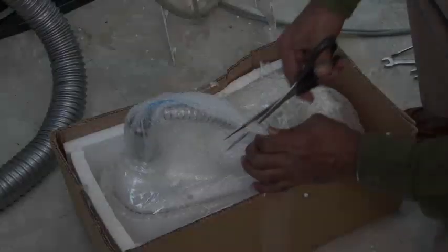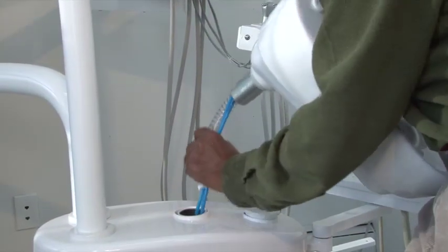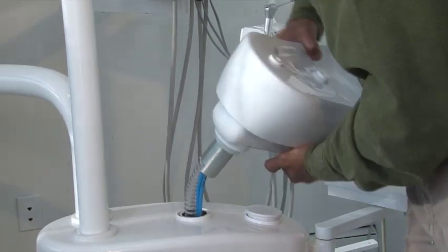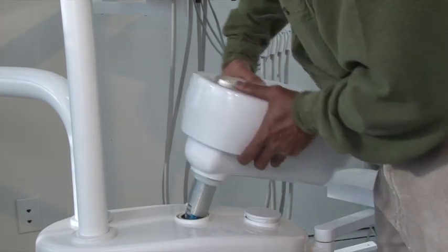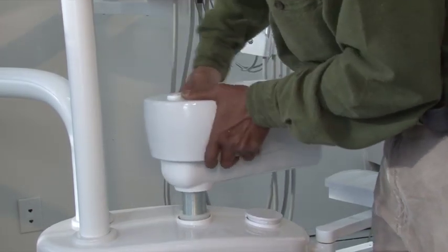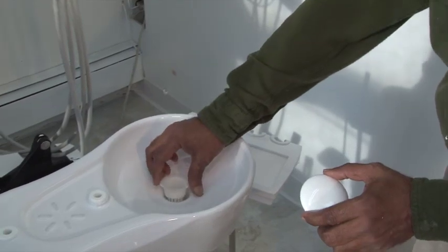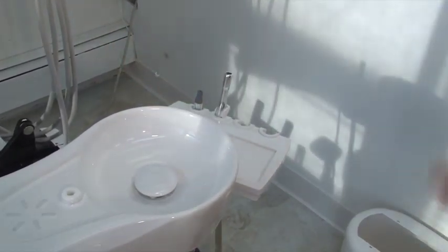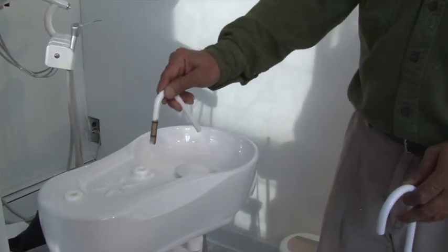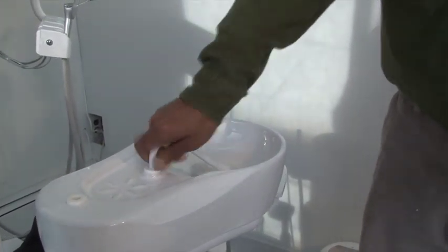Remove the protective plastic covers from the cuspidor. Insert the tubing through the cuspidor holder — the tubing are all marked — and place it on the cuspidor holder. Locate the cuspidor filter and the cap from the accessory kit and position them in place. Locate the cup filler and cuspidor water tubing and attach it to the cuspidor.